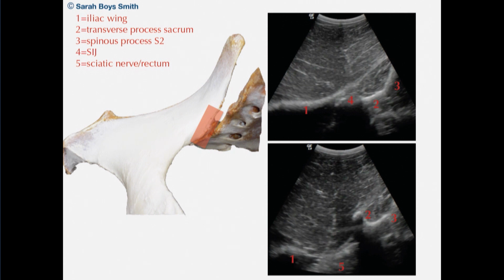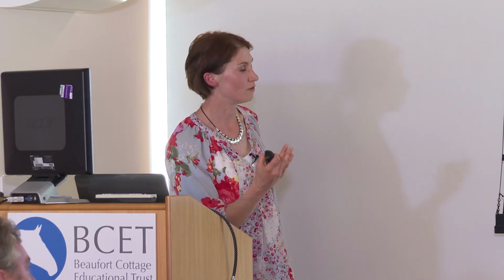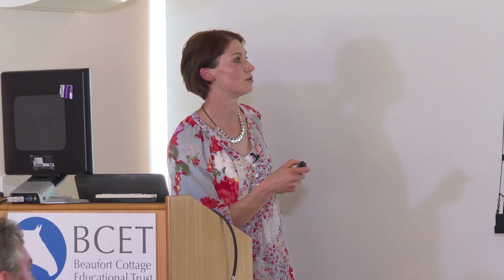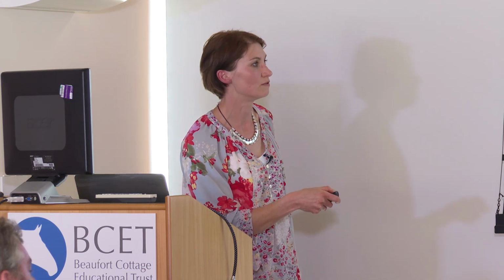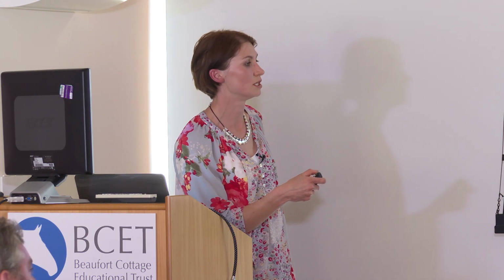Okay, so it's not particularly a useful method in terms of establishing pathology in that area ultrasonographically, but it's important to know where it is, particularly in relation to potential stress fractures for racehorses. And if you are considering medicating the sacroiliac region from the caudal aspect, then obviously this is the area that you need to visualize in order to guide your needle most accurately to that area.